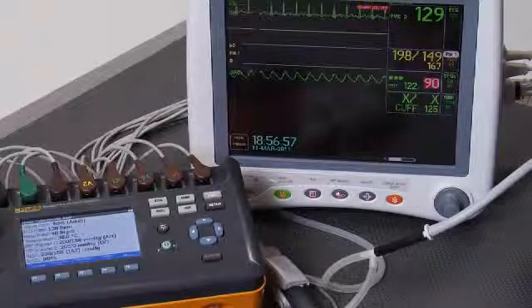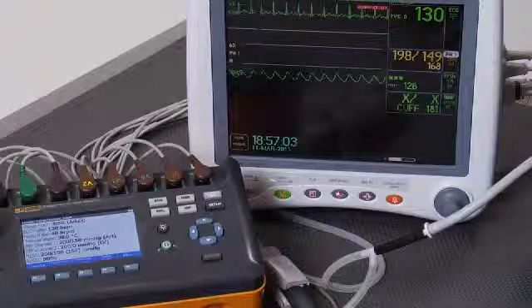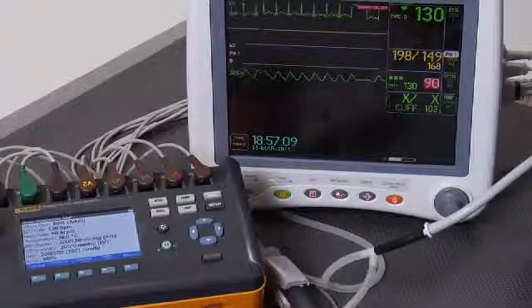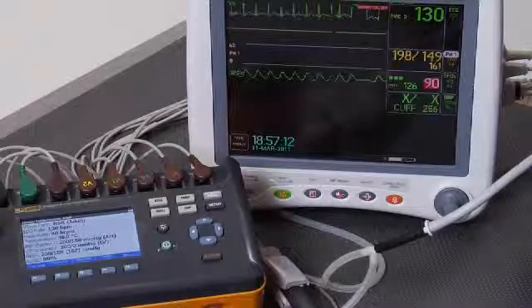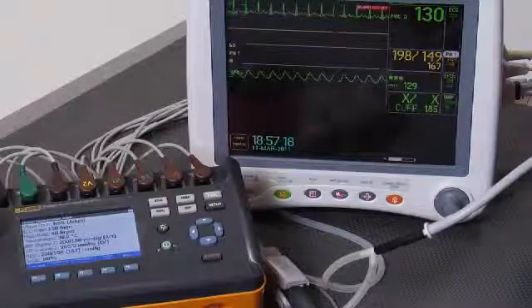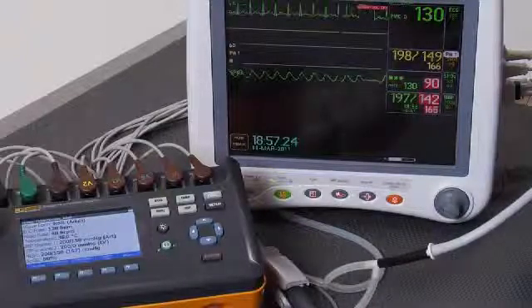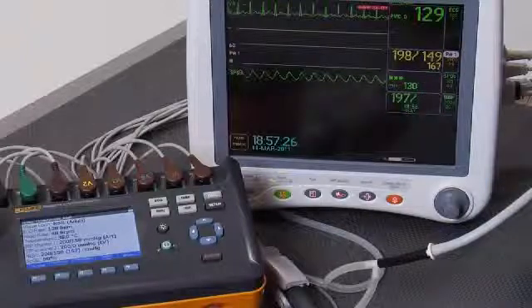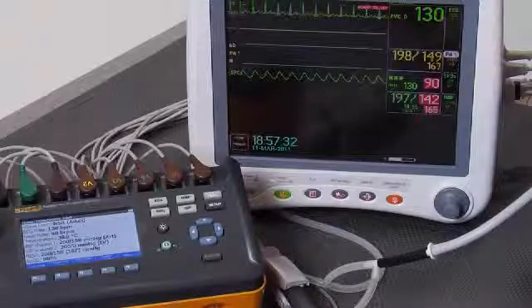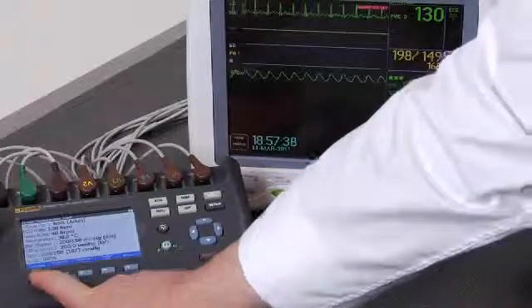In this case, we're looking for an ECG rate of 130 beats per minute, respiratory rate of 40, an invasive blood pressure display of 200 over 150, NIBP of 200 over 150 with a mean of 167, and an SpO2 reading of 90. And it looks like we've got all of those on the patient monitor: 130, invasive blood pressure 198 over 149 with a mean of 167, O2 sat of 90, and 197 over 142 with a mean of 165 on the cuff. Let's move to normal.